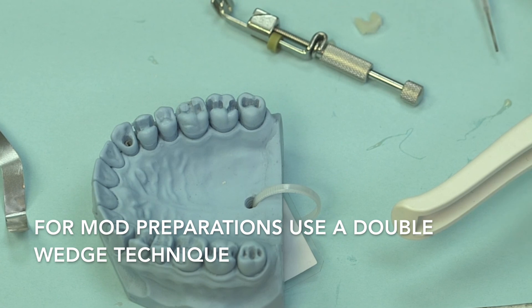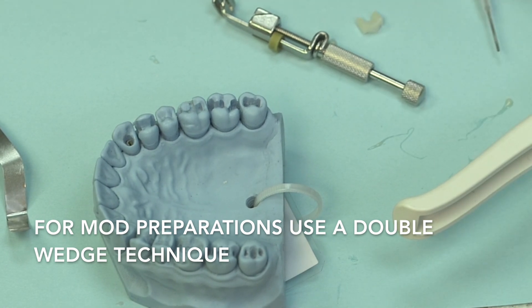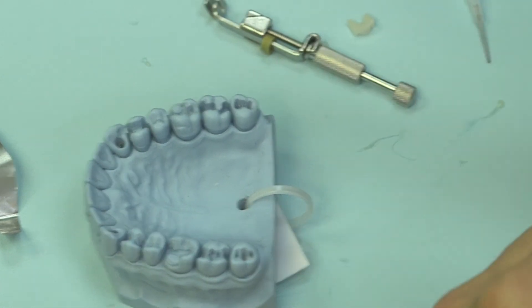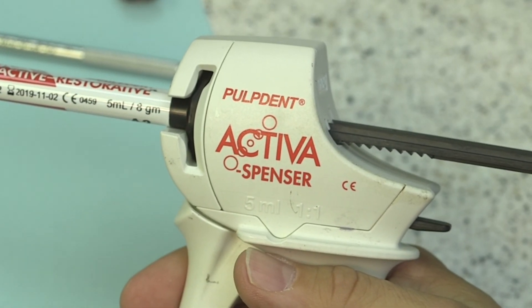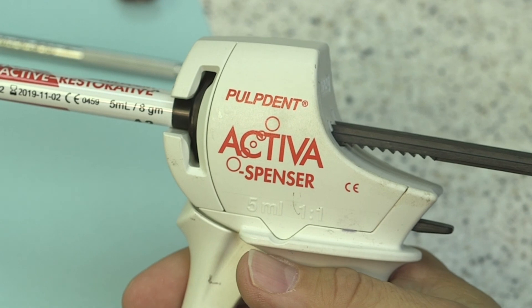So whether you're using a traditional type of composite or an injectable type of material like Activa, you have to create your contacts in your matrix band. That's a very important first step.